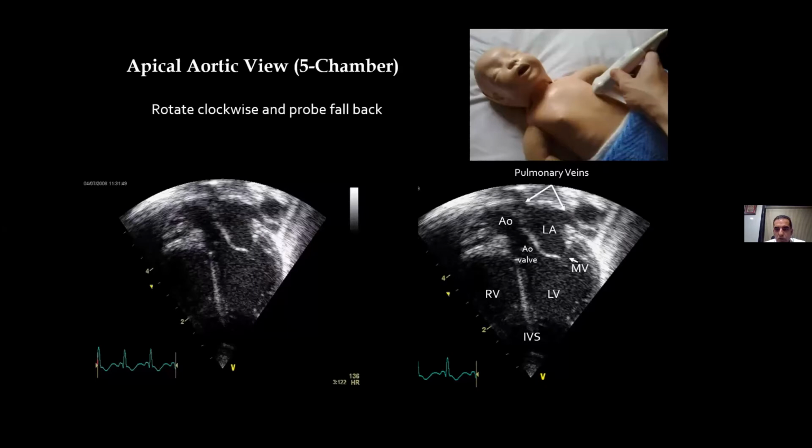So now suppose if you are in this view and there is a VSD in this, the flow of the VSD is from left to right. Okay. So if I am calculating, my beam direction is like this because this is a probe orientation marker. So if my flow is like this, my beams are perpendicular to it. So they are against the basic principle of sonography.